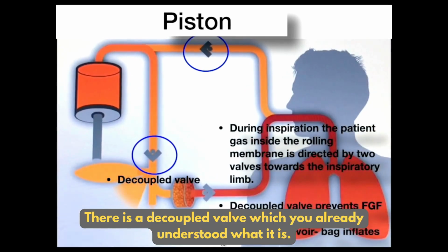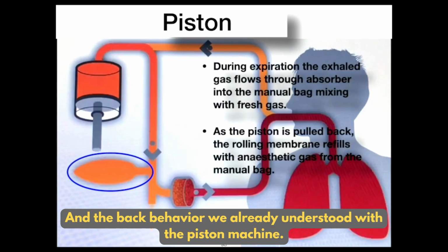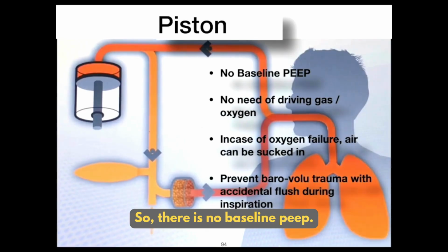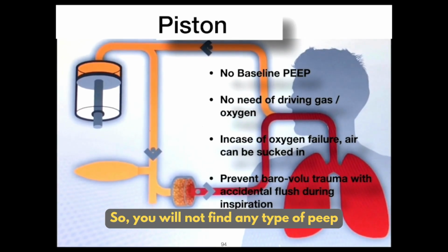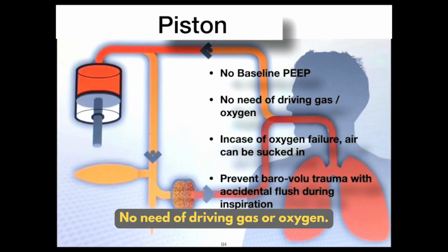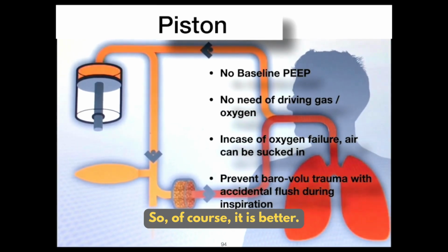There is a decoupled valve, which you already understood, and the bag behavior we already understood with the piston machine. So there is no baseline PEEP. You will not find any type of PEEP in a piston machine. No need of driving gas or oxygen, so of course it is better.